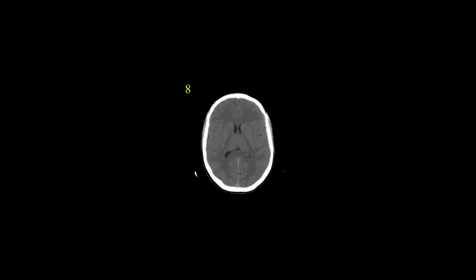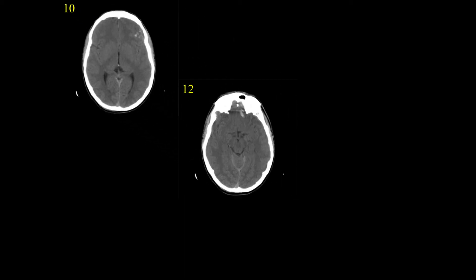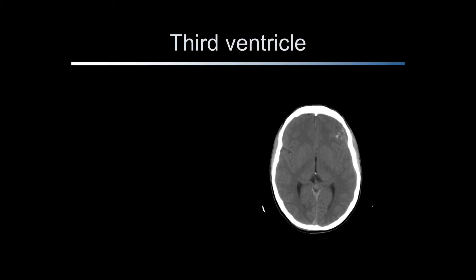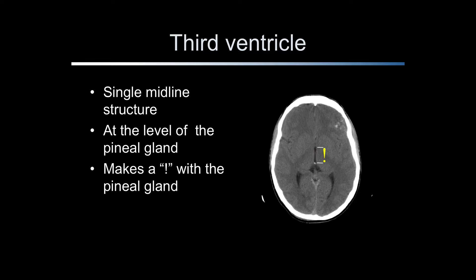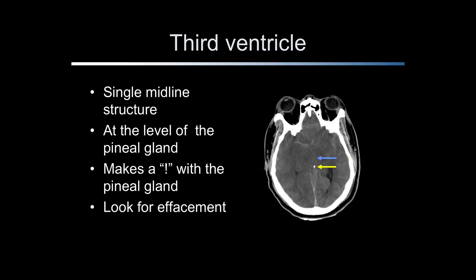The third ventricle is a single, midline, slit-like structure located at the level of the pineal gland. The pineal gland is typically calcified in adults and doesn't usually become calcified until after the age of six years. It has no blood-brain barrier and will appear enhanced with contrast. The third ventricle sits just anterior to the pineal gland and is seen here in yellow. The third ventricle makes an exclamation point with the calcified pineal gland. The effacement of the third ventricle is a sensitive finding for early mass effect due to extra-axial bleeding, tumor, mass, or edema.